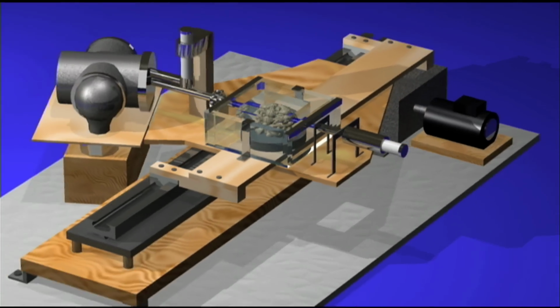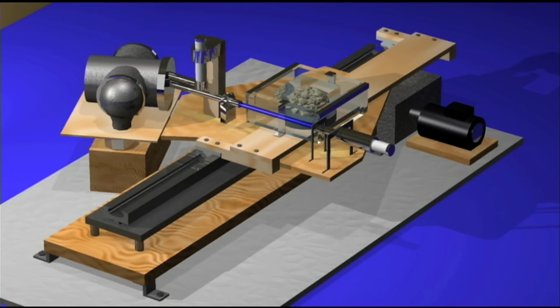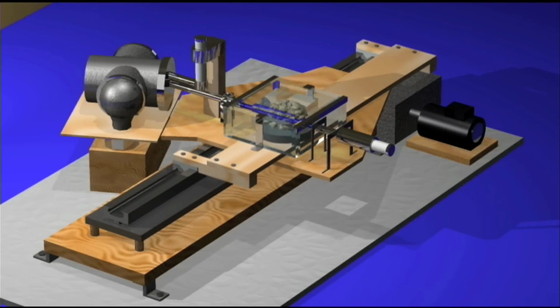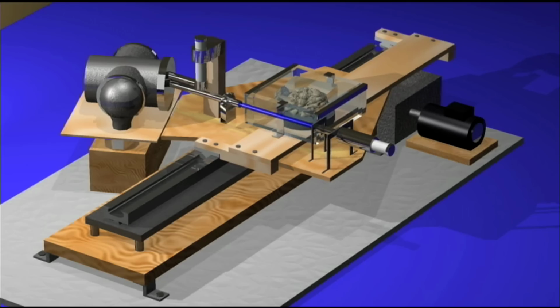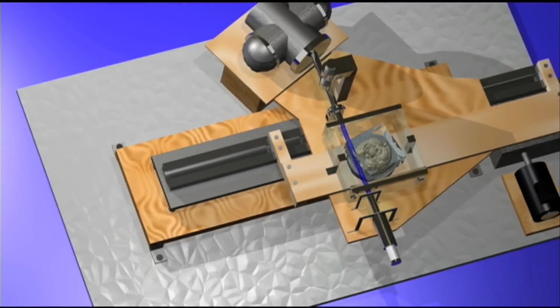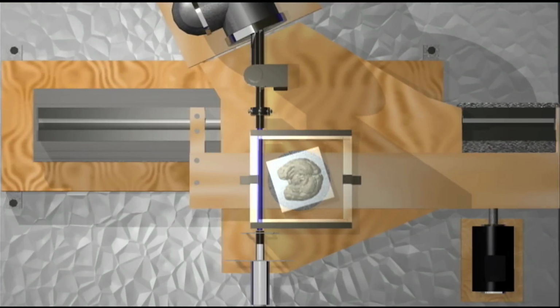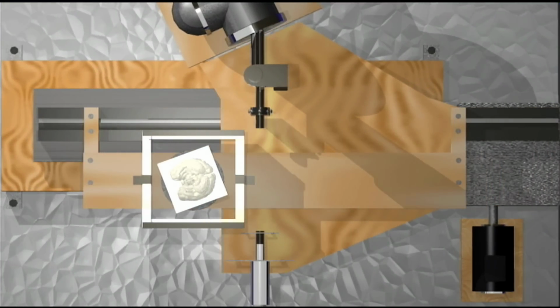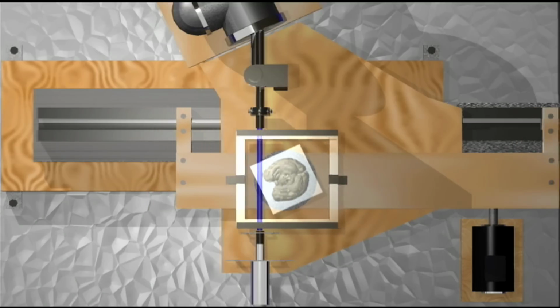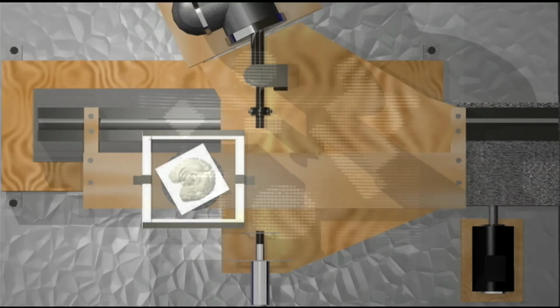There was a pencil beam collimation in the front of the scanner. It passed through the objects and was picked up by this single detector on the far side, and the objects would move through that pencil beam X-ray source, rotate 1 degree, pass again through the X-ray source, and do that 180 degrees all the way around until you had a complete scan of the image. This was called a rotate and translate.